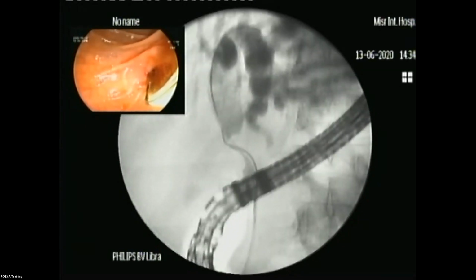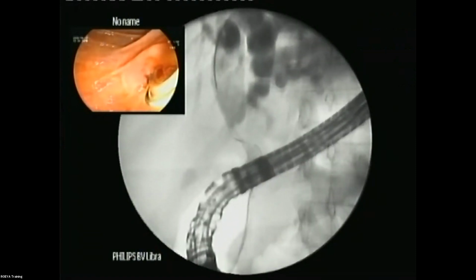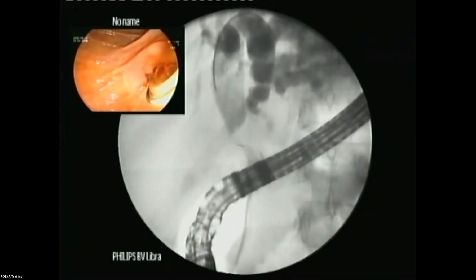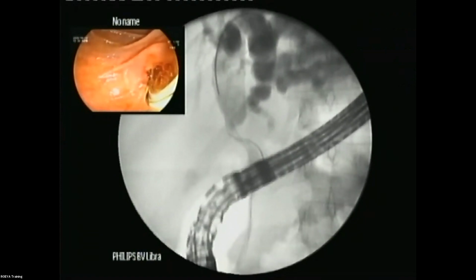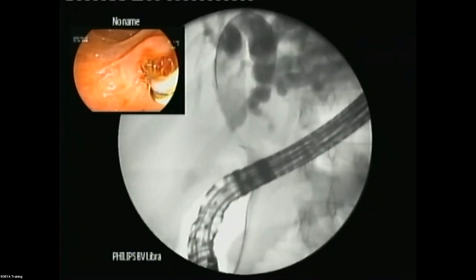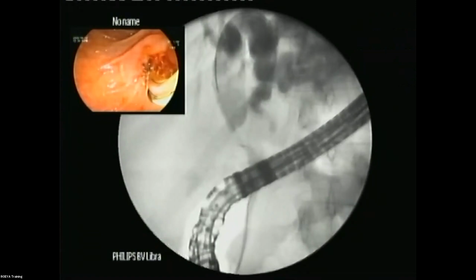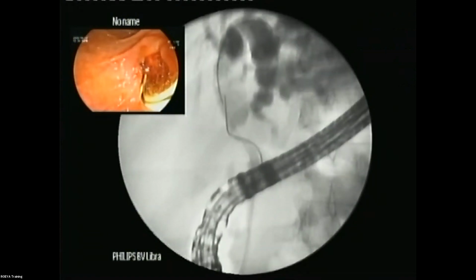Yes, it is a very valid point, but you have to take into account the patient's preferences. We are doing this procedure only for the benefit of the patient, to make him live a better life these last few months. So he said, no, I don't want to have a tube outside of me. So of course you have to tell him that there's a big chance that you will need an ERCP and a PTD. Again the question, if you have a patient like that, do you start by PTD or do you start by ERCP?